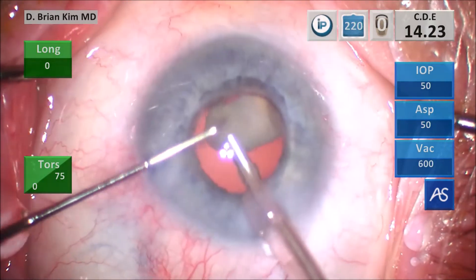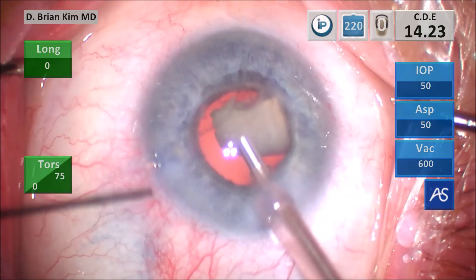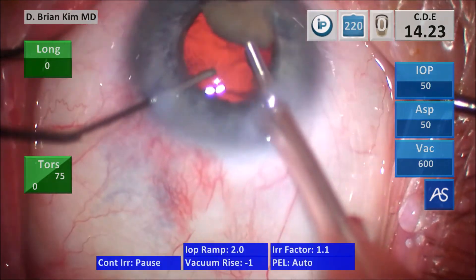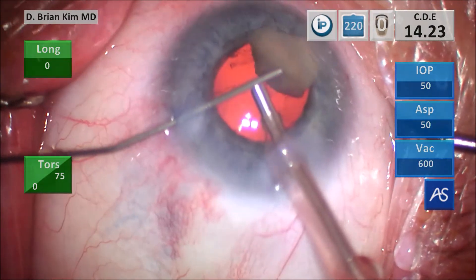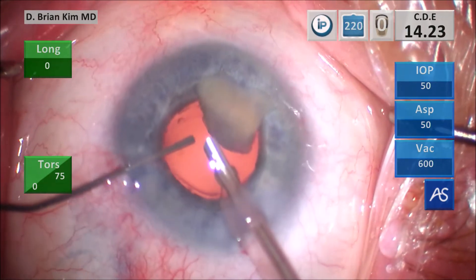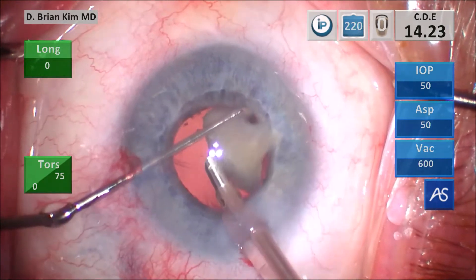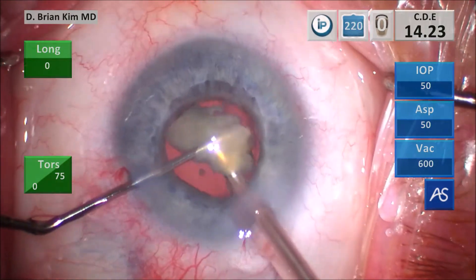I'm fracturing the lens with mechanical fracturing forces and then buzzing and emulsifying the lens piece. I'm trying to keep that vitreous back, so I go ahead and push more dispersive viscoelastic to plug up the hole and keep the vitreous back. I'm also coating the corneal endothelium for this last piece. The point is I'm trying to use mechanical forces to fracture the lens into smaller and smaller pieces, bring the piece to the tip, then fracture the lens pieces when those pieces are on the tip — that way you're eating the piece rather than removing the viscoelastic. The last thing you want to do is remove the OVD because it's going to encourage more vitreous to come forward.